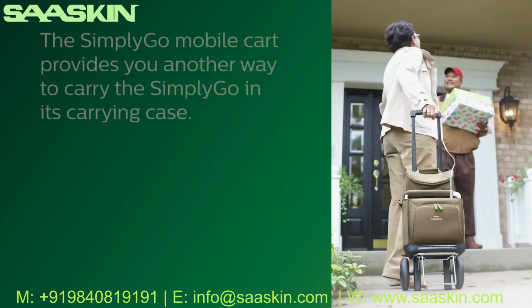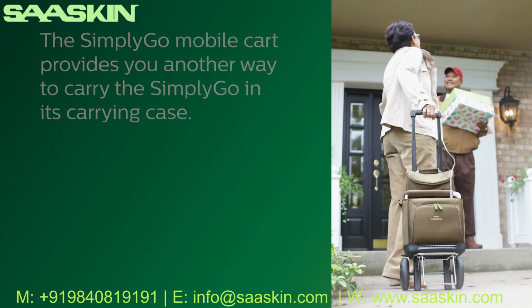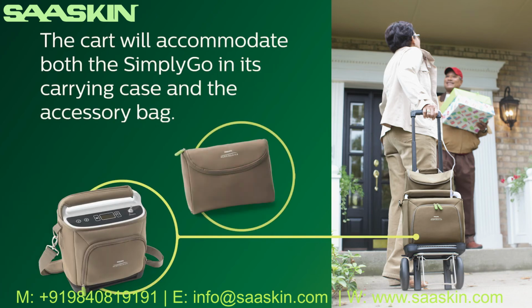The SimplyGo mobile cart provides you another way to carry the SimplyGo in its carrying case. The cart will accommodate both the SimplyGo in its carrying case and the accessory bag. Please follow the instructions included with the cart for safely securing your device and accessories.